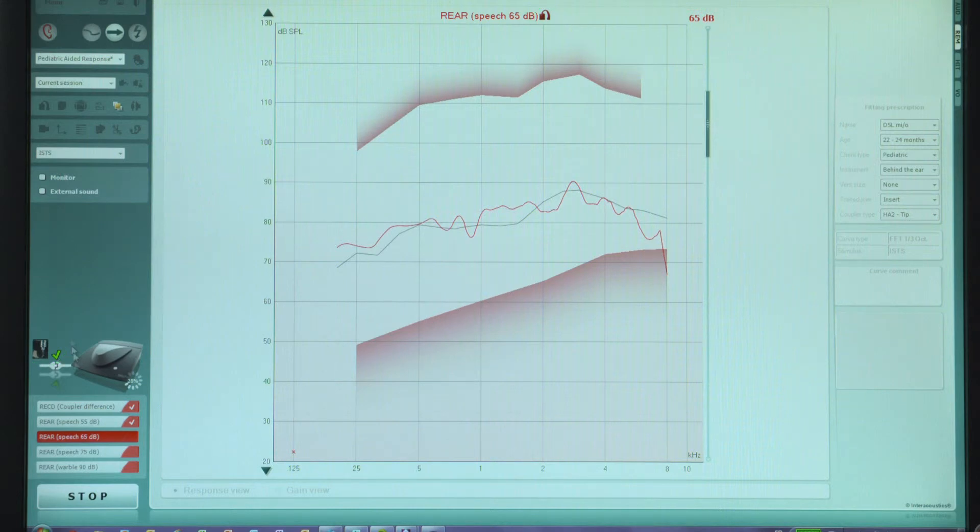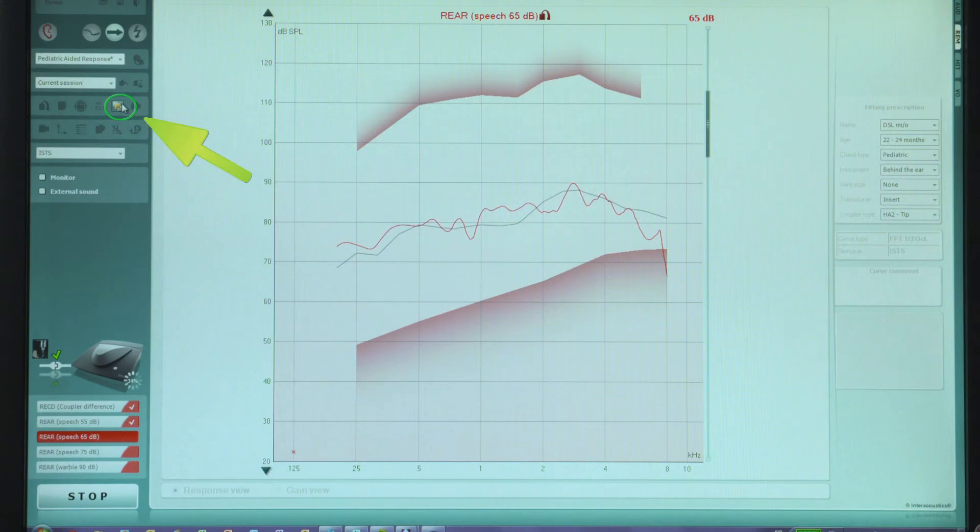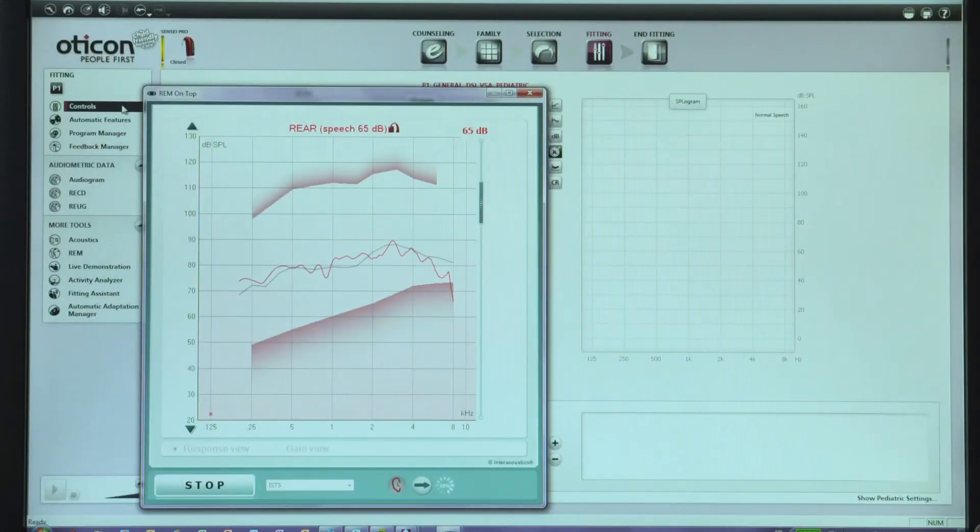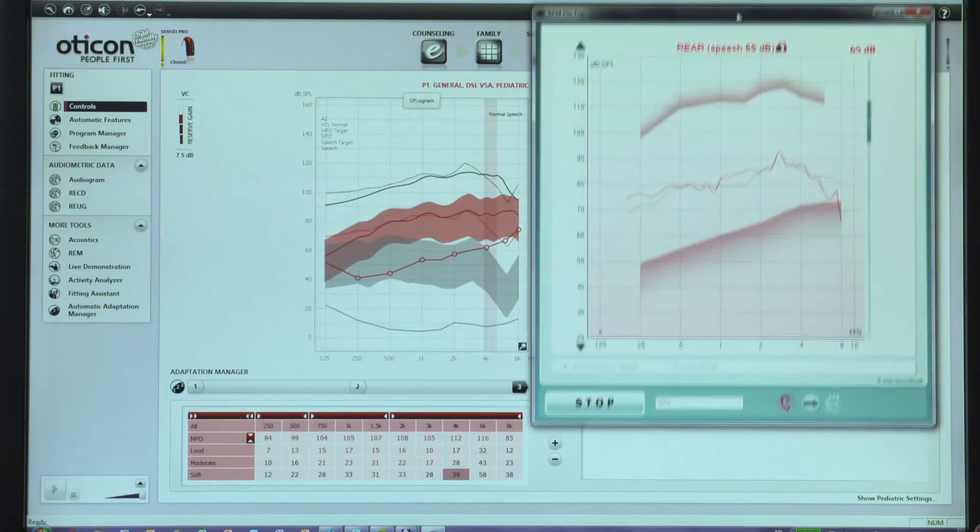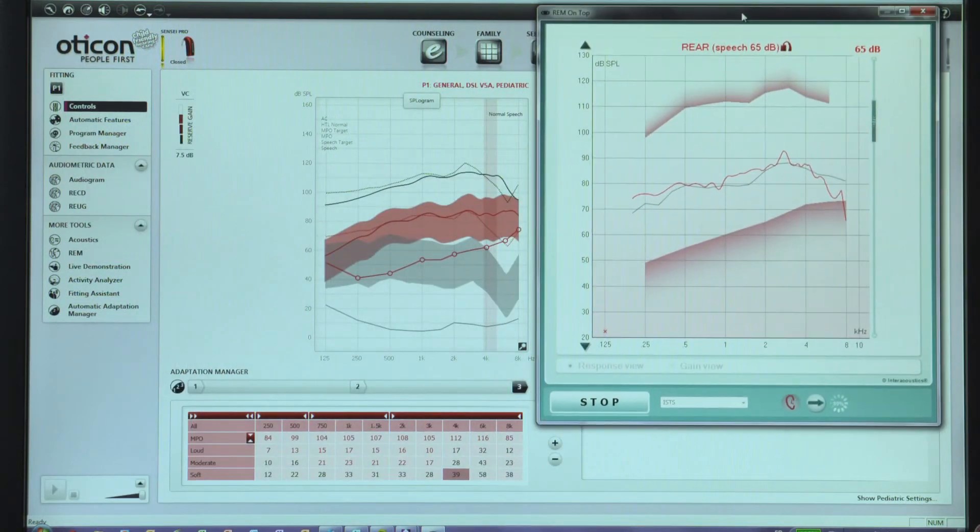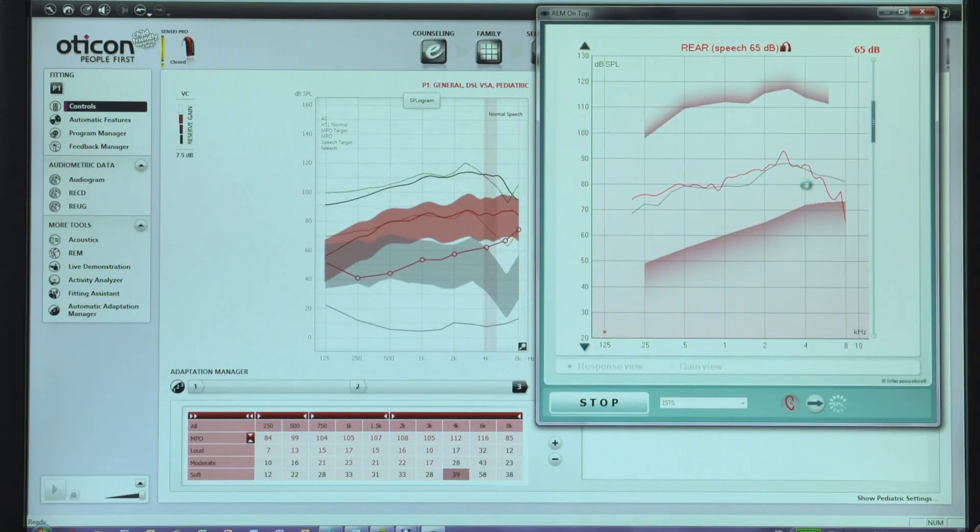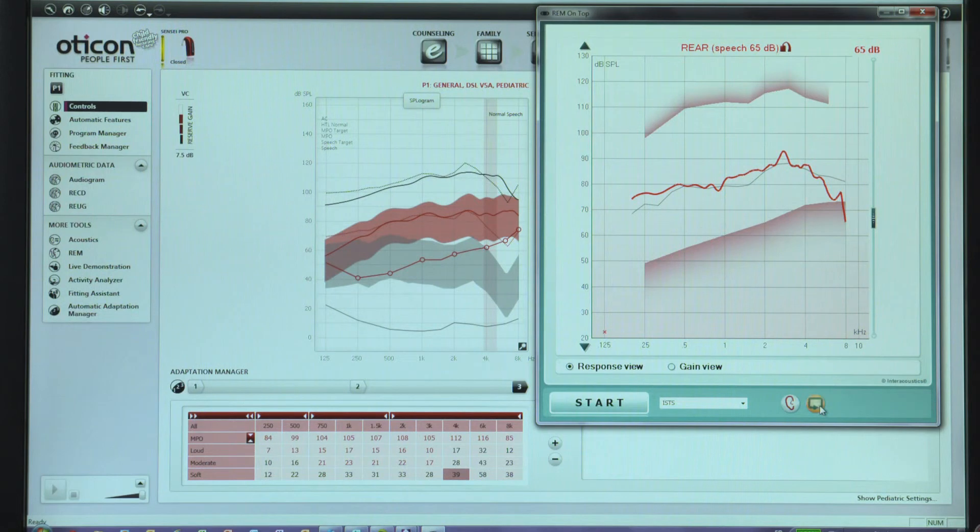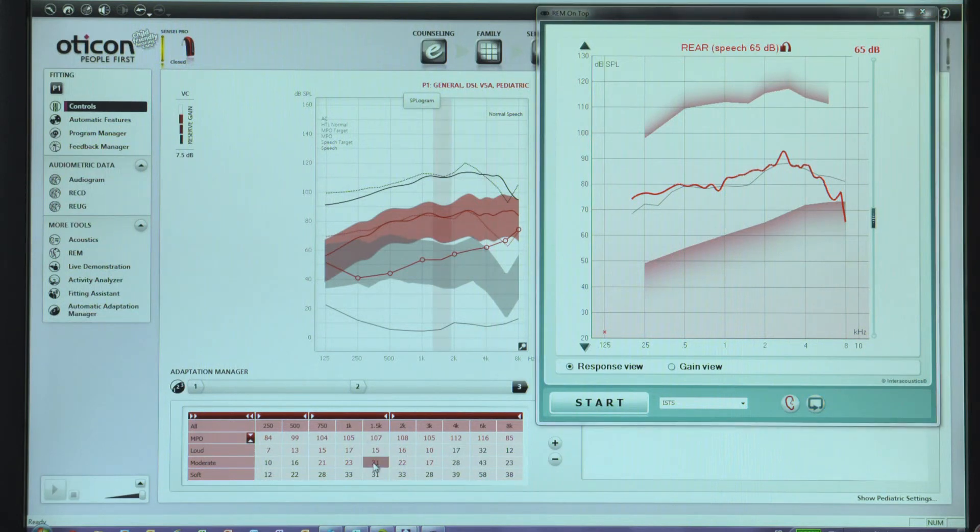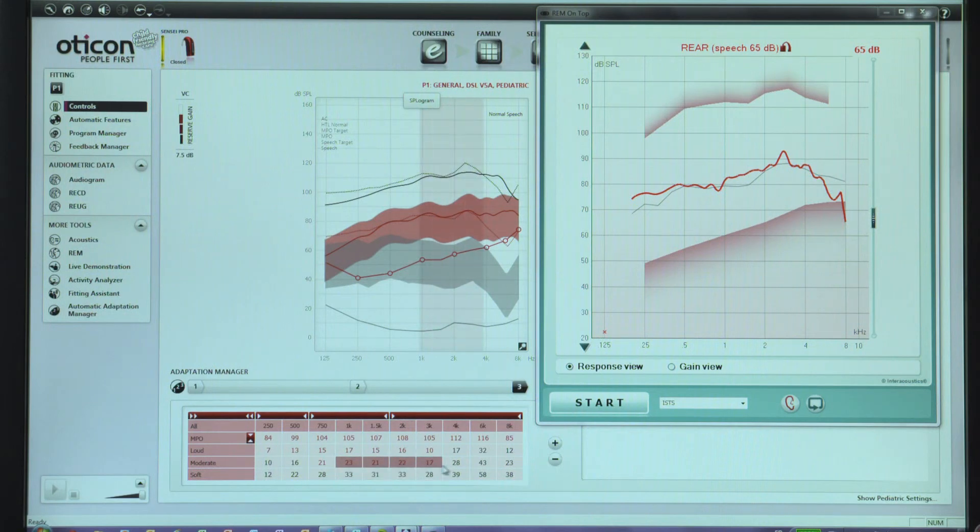If the levels need to be adjusted, click on the On Top Mode button. The On Top Mode button is useful as it allows the affinity window to float on top of the Gini screen for easy comparison. Start with a level of 65 dB, then measure soft, loud and MPO. Adjust in Gini if necessary so that the hearing aid frequency response matches the DSL targets.